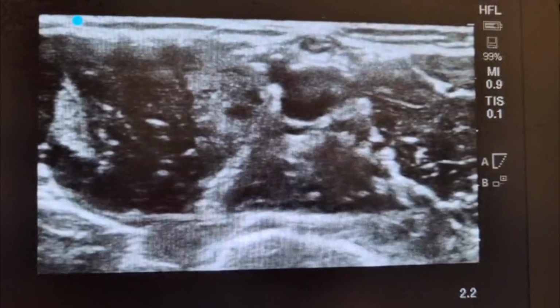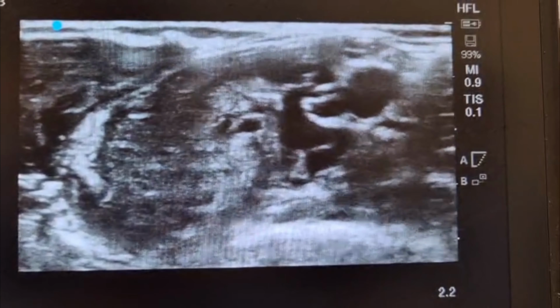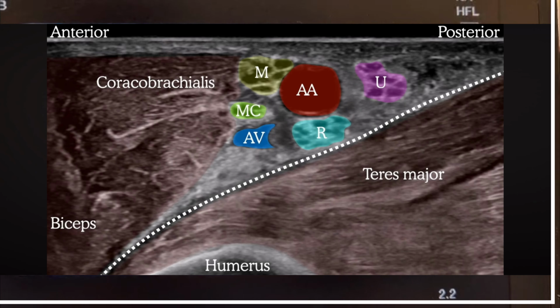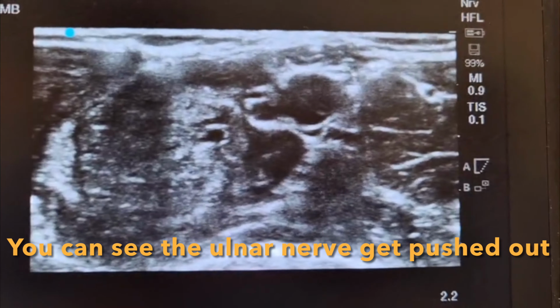So aspirate, 1 mil. If you could go slightly up, yeah, slide along that layer. Okay, hold it. So that looks now to me the one. If you could press a bit harder, okay. Let's go hydrodissect above that round thing. Okay. Slide above that. Yeah, good. Go. Okay, fantastic. You go to the other side. You could see that still that round shape stays. Yeah. So that's the nerve.